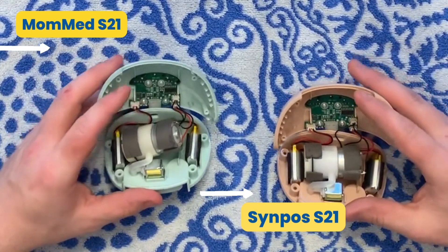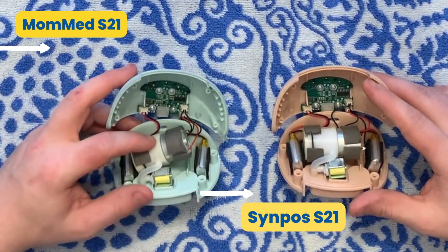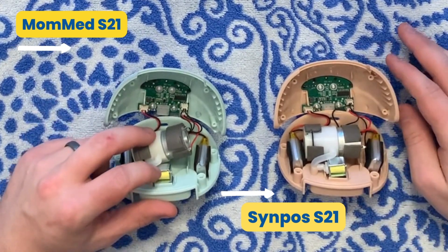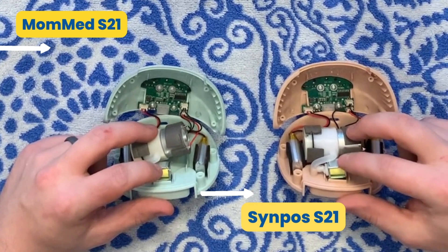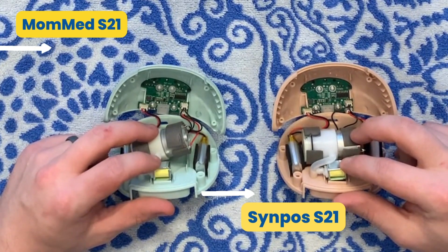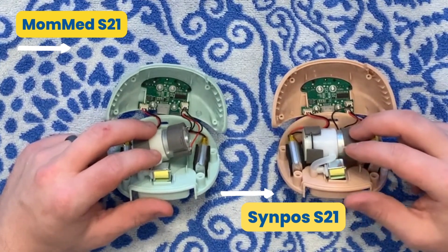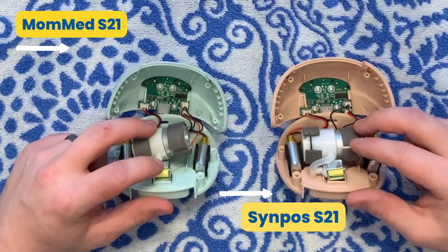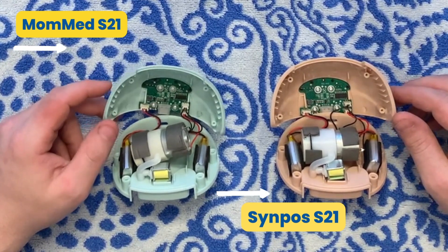Comparing these two pumps, they're virtually identical in terms of build — interior and exterior. Really the only noticeable difference is that the motor and the pump between the two: these two are a matched set, meaning the sub-tier supplier that provided them likely designed them to work together, whereas these two did not. What that means is the company that provided this pump probably just bought whatever motor and whatever pump were the two cheapest that met the same form factor to save a small amount of money. This adds just a little bit of risk that one of these components could burn out, but they look virtually identical and are probably made to the same exact set of plans — just a different company up the road made them. So if you were to buy either of these, you're probably getting pretty much an identical pump with pretty minimal risk.